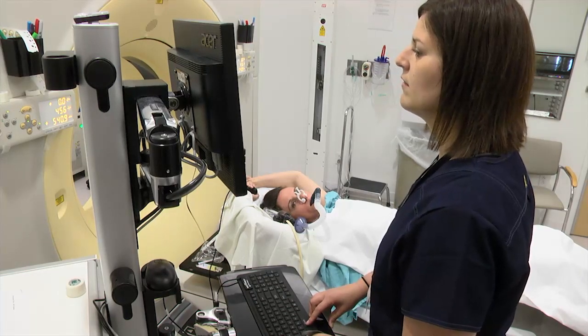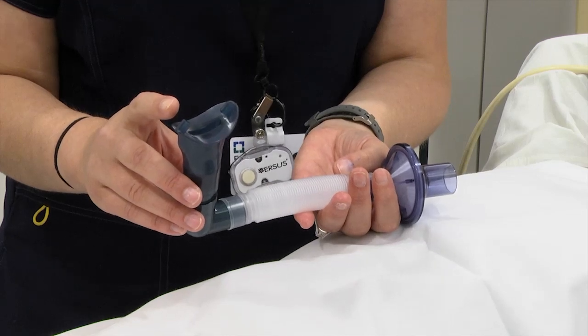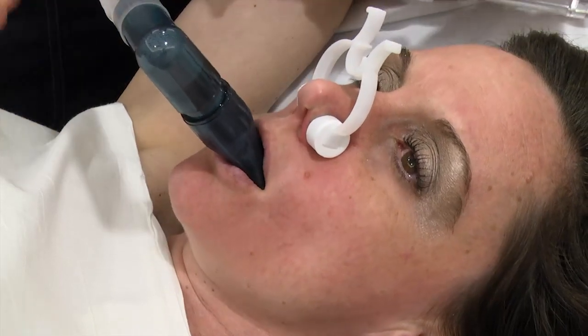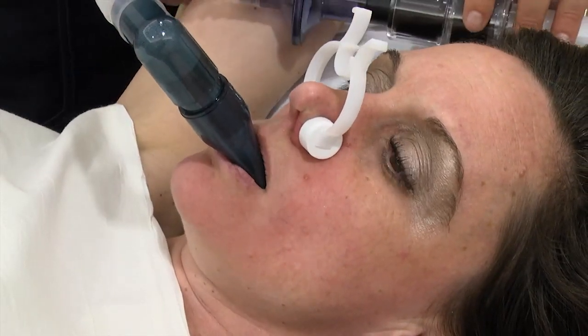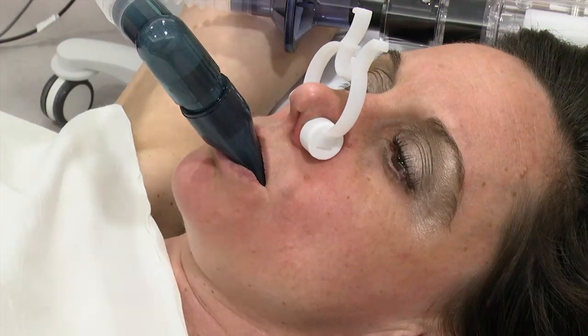Here's how the process works. You will be breathing through the snorkel. The snorkel has two teeth. The therapist will ask you to bite on the teeth and place your lips tightly around the mouthpiece. Try to breathe normally through the snorkel.